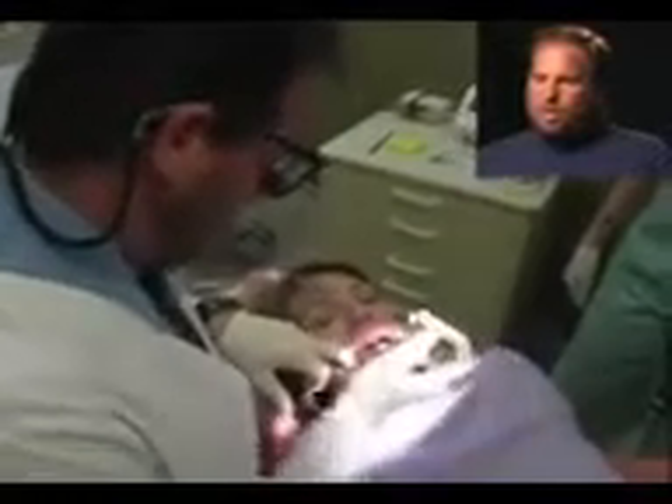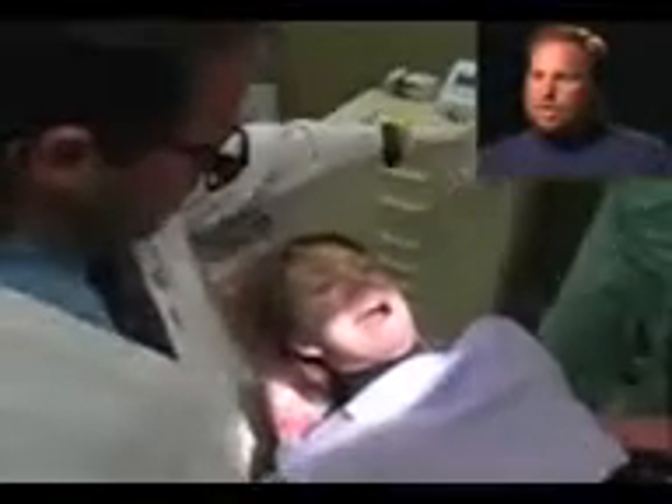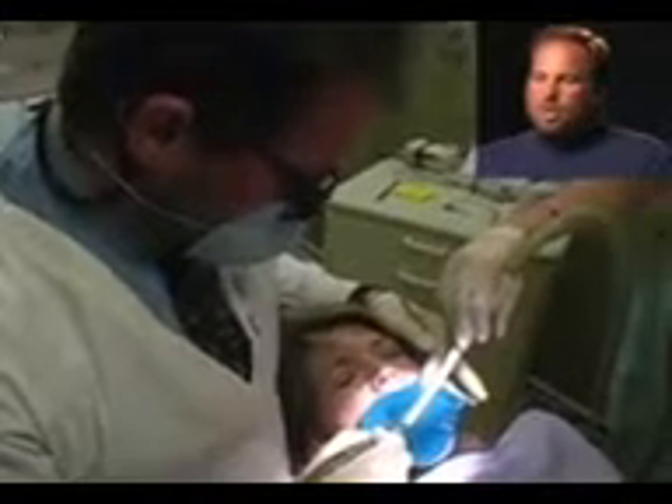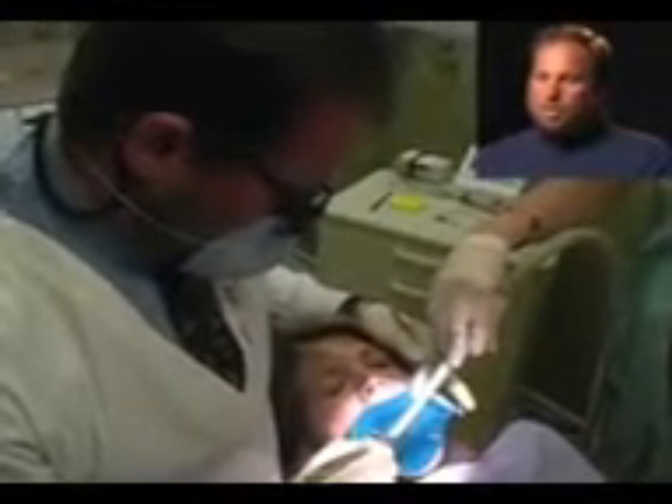We go ahead and place a clamp around the tooth that we're going to root canal, and then we isolate the tooth with a rubber barrier called a rubber dam. This isolates the tooth and keeps the area clean while we're working, and it keeps debris out of the mouth as well. Then we open the tooth up.